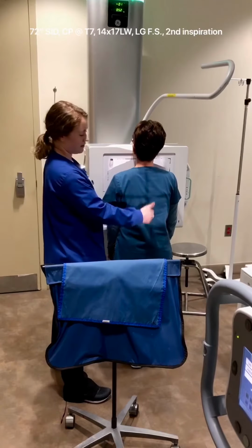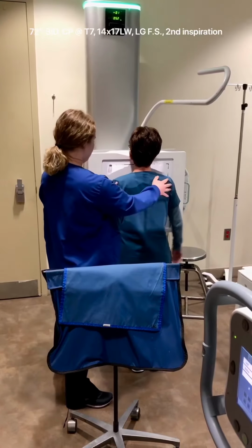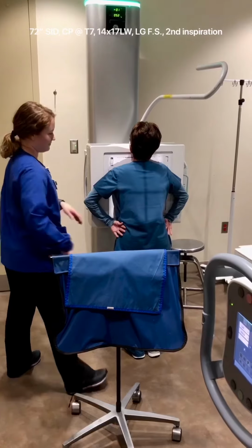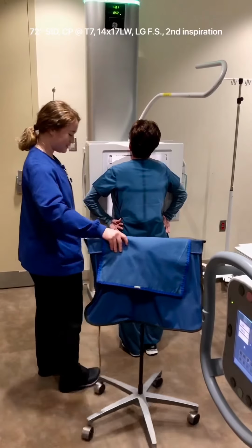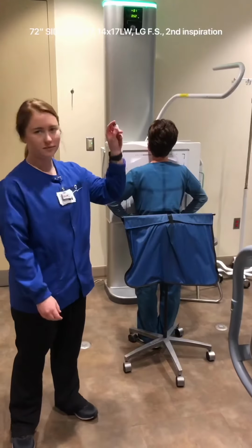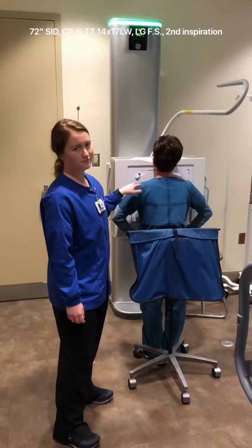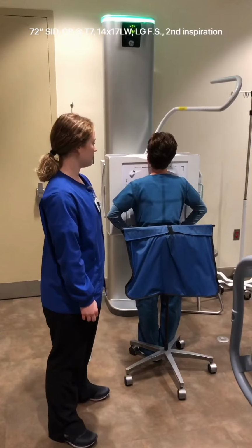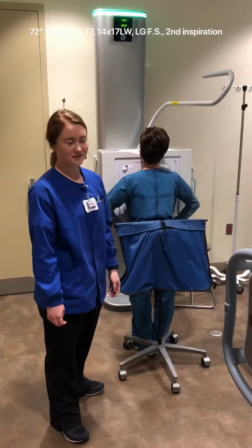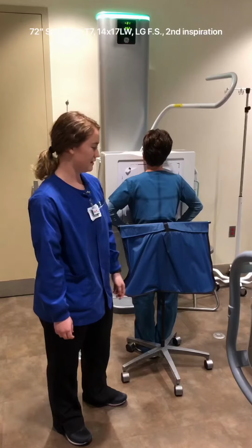And then you'll want it down her mid-sagittal plane. You roll your shoulders forward and then put the backs of your hands on your hips. Make sure you shield to protect her gonadal area. Make sure you put your left marker on the patient's left side to mark that it's her left side on the image. Most cystic fibrosis patients are hyposthenic, so you're probably going to be able to collimate down, which I already did.